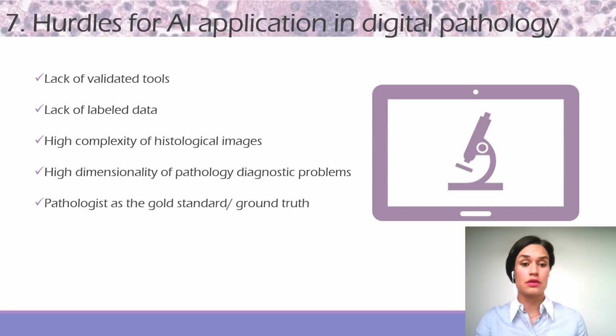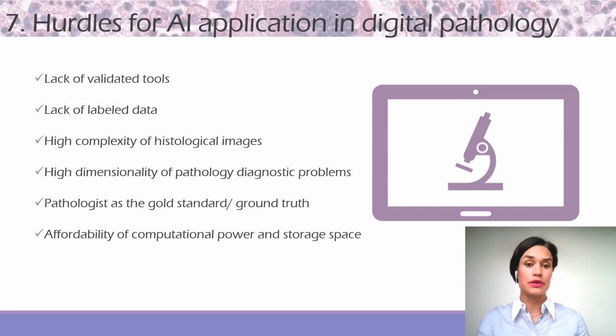If an algorithm is going to be close to what one pathologist says, does it mean that it's a good one if another pathologist says something else? So that's a hurdle. And the affordability of computational power and storage space is a problem. Those GPUs that are required for processing these huge slides cost a lot more than a normal PC, a normal computer. So that's a hurdle, and we need to store somewhere those digital slides, enormous amounts of data.